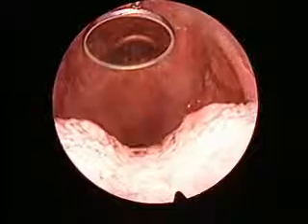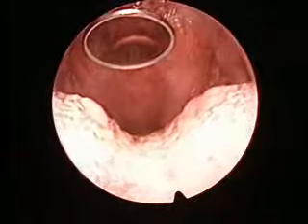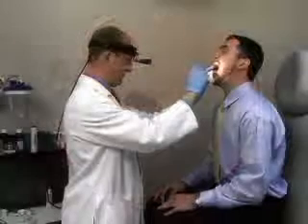Occasionally, patients may not tolerate this examination due to a prominent gag reflex, apprehension, or discomfort. In these instances, apply a mild topical anesthetic to the throat and reattempt the exam. However, sometimes the examination cannot be tolerated and flexible laryngoscopy should be performed.